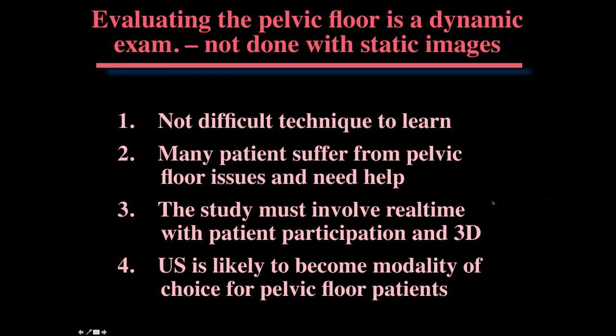Somebody says, I most often do transabdominal pelvic floor exams looking through the bladder to see the pelvic floor muscle contraction. Have you seen the benefit from addressing muscle function transperineally? I think that's an area of great interest to look at the muscle contractions and function. I think a lot of people get physical therapy for pelvic floor dysfunction. I have not addressed this myself, but it's certainly an area that would be interesting to evaluate and look into further.